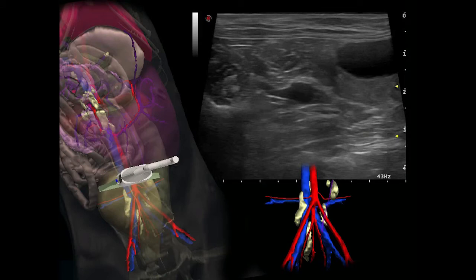As with the identification of mesenteric lymph nodes, the sublumbar nodes are much more easily identified by first locating the aorta and vena cava and their caudal bifurcation. The bladder, located ventrally, can be used as an acoustic window and is a good starting point when searching for these vessels. Note how the caudal vena cava is flattened due to pressure from the probe, as opposed to the aorta on the left, which is on the right in the transverse image, whose lumen remains circular.